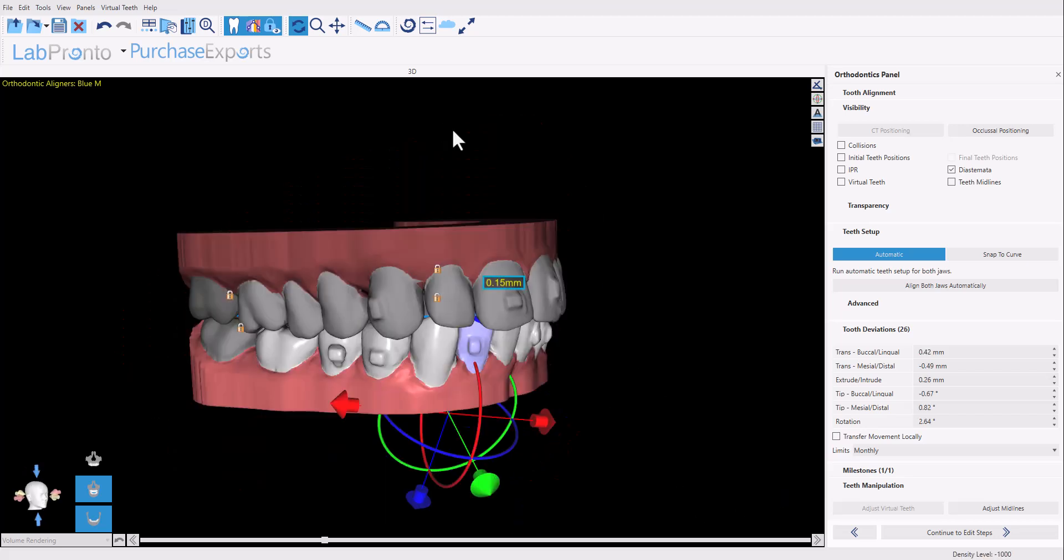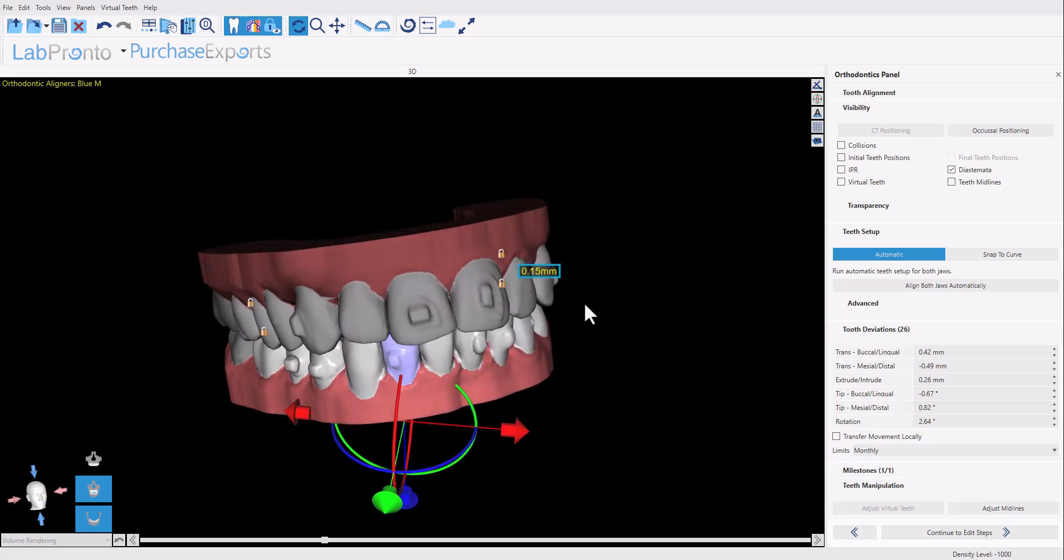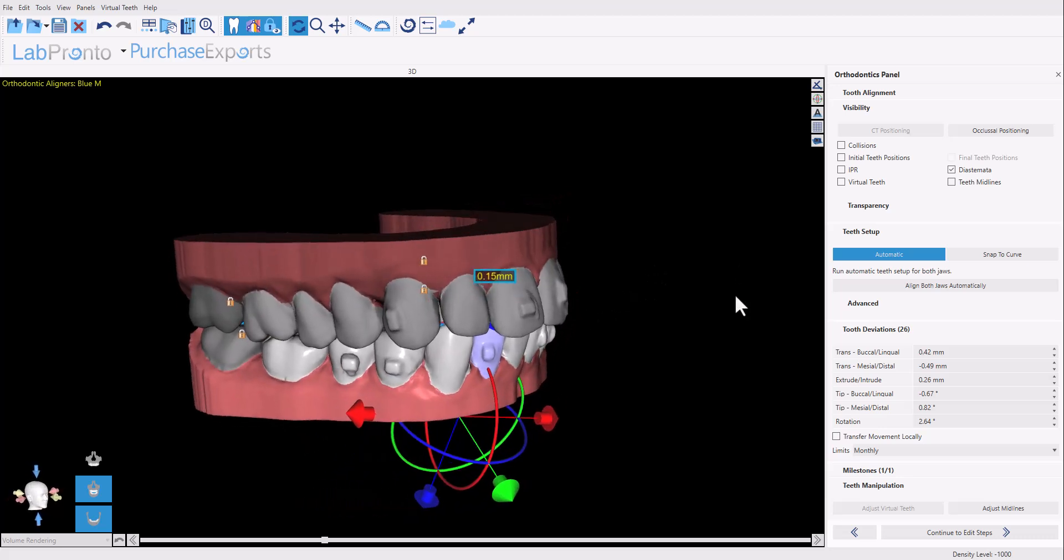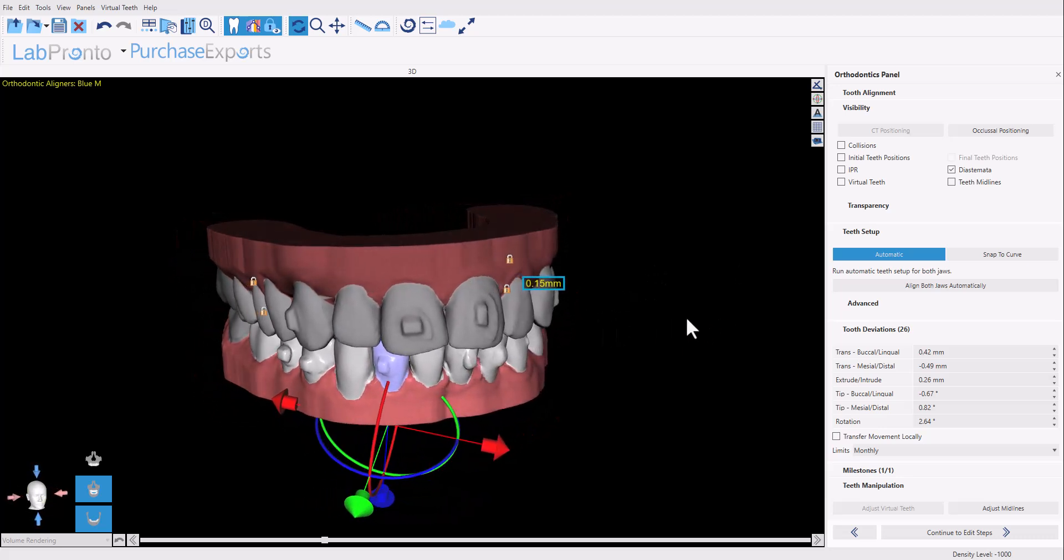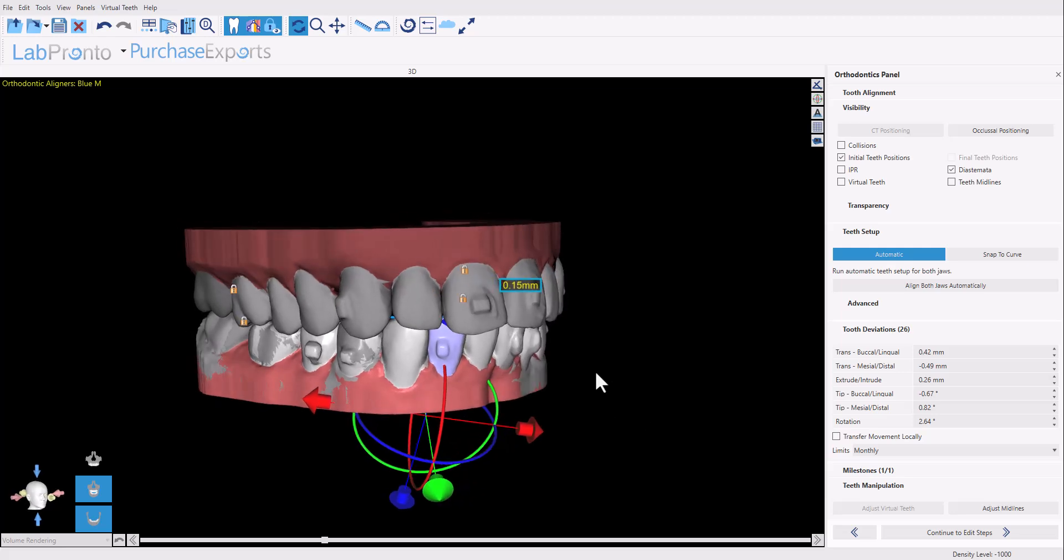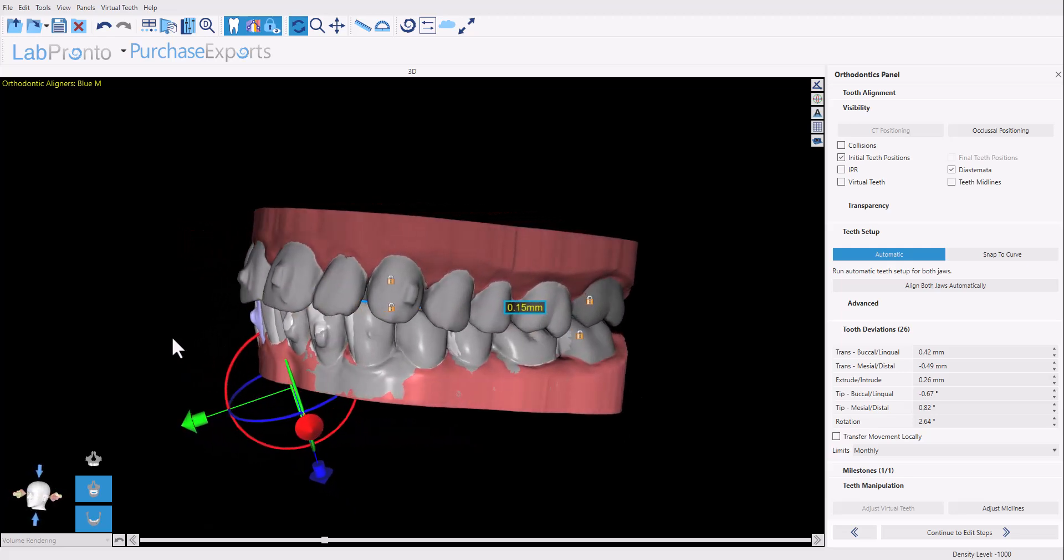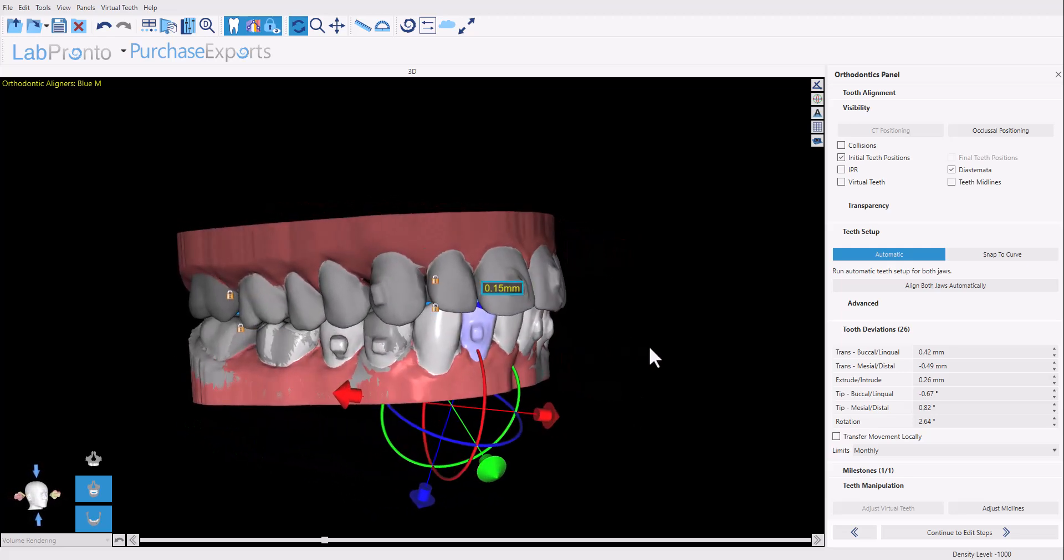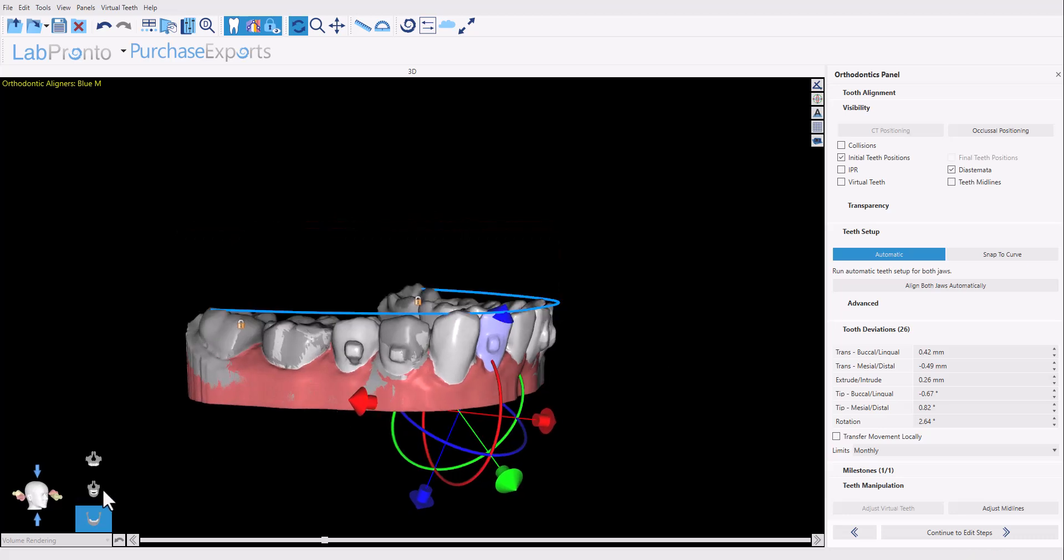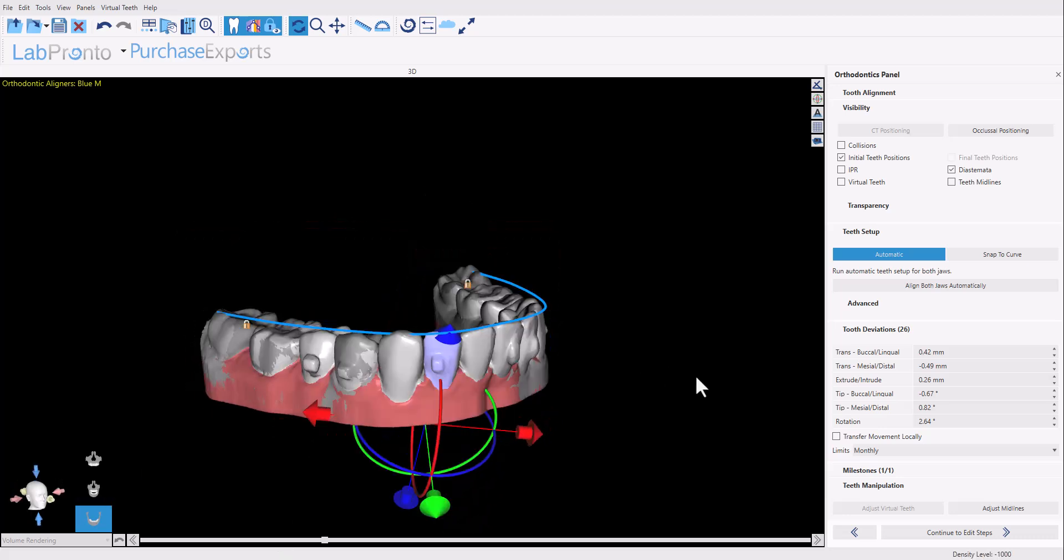The software is now showing us the new data set with the final teeth positions from the original tooth setup in the previous treatment plan. If we toggle on initial teeth positions, we could see the initial teeth positions in this data set versus the final digital tooth setup.